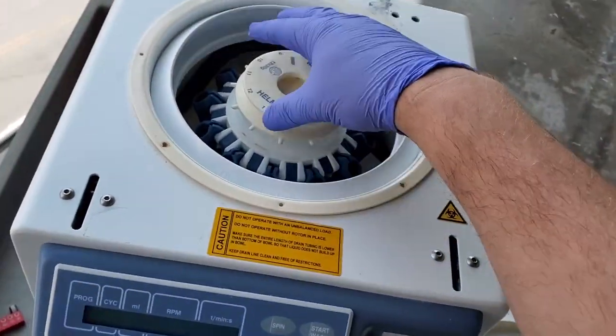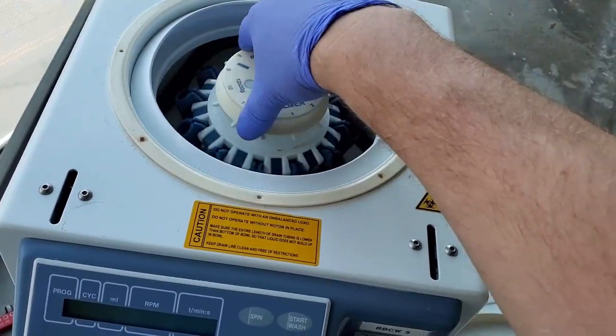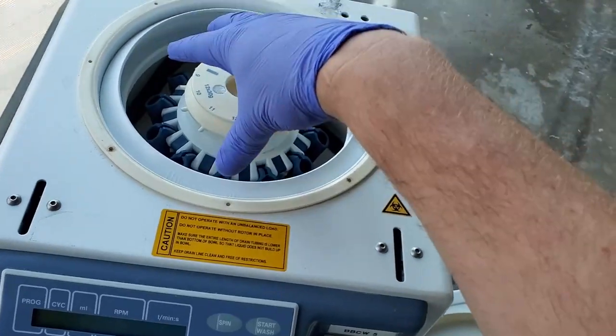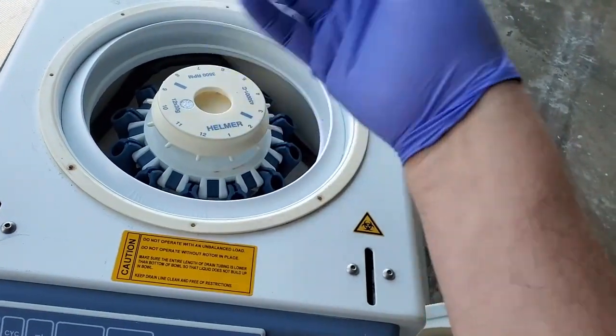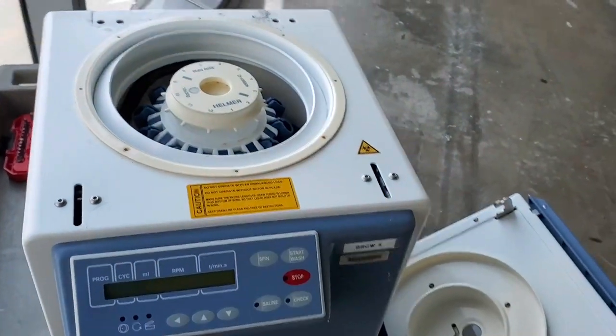The tachometer error on this unit appears as soon as you boot it up because it doesn't want to spin freely — it was completely locked up. After pulling some things apart, I got it moving, and we'll get into that later.